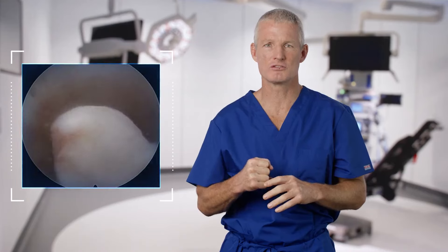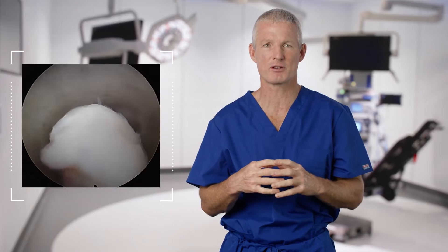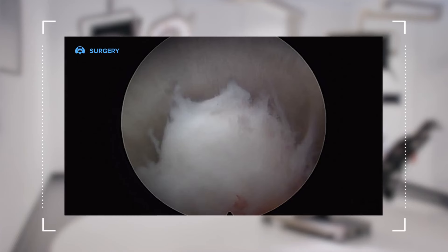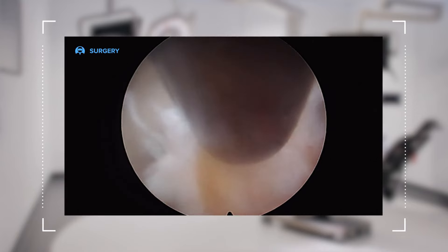Now that the nerve root is safely out of the way and retracted by twisting the cannula, the next step is to deliver the herniation. I use the cannula to place downward pressure on the top of the annulus. In my experience, I frequently find that the disc herniation is pressurized inside the annulus, and with downward pressure, the herniation is delivered into the cannula so that it can be grasped with a pituitary rongeur. As demonstrated here, the herniation delivers itself into the cannula so that it can be safely removed, taking care of the herniation that has been causing all of this patient's pain and neurologic dysfunction.